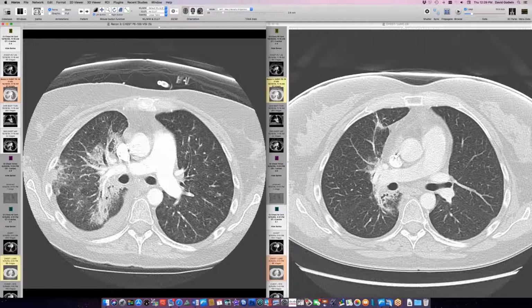It typically responds to steroids, and I think in her case it did well, but I don't follow up CTs past this. So recall pneumonitis, have you guys dealt with this before? I don't think I've recognized an instance of it. If it's not occurred at Emory, it doesn't really exist. I feel like we've seen ones that are potentiated by certain drugs, but I'm not really familiar with the term recall pneumonitis, but that's very cool. We have not used that term either.